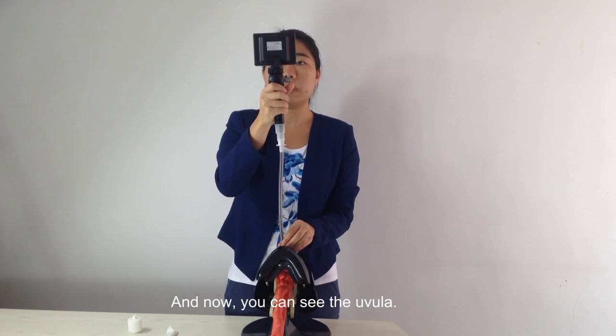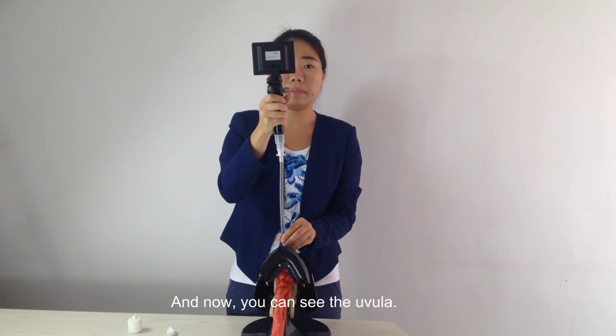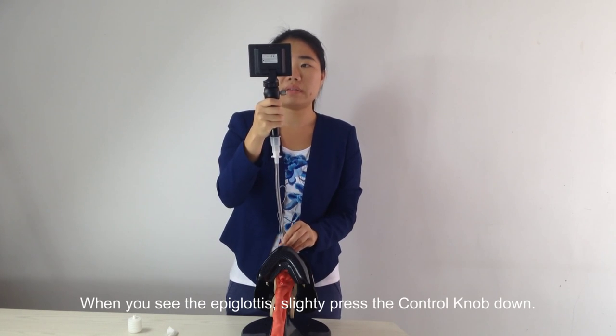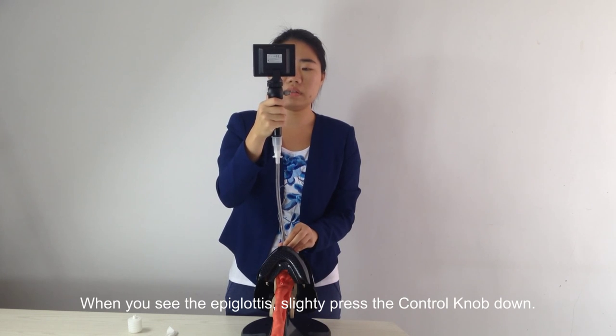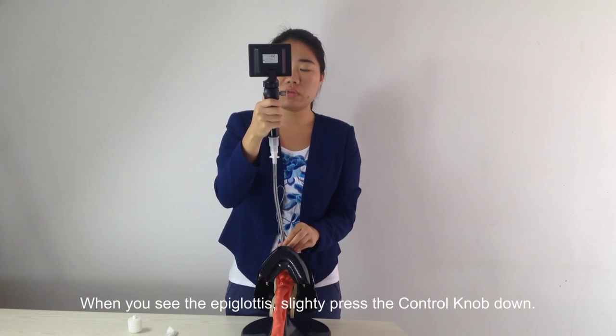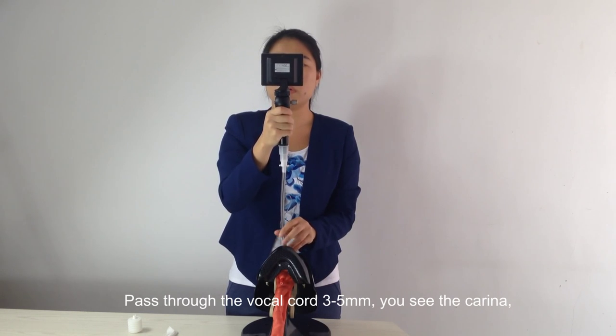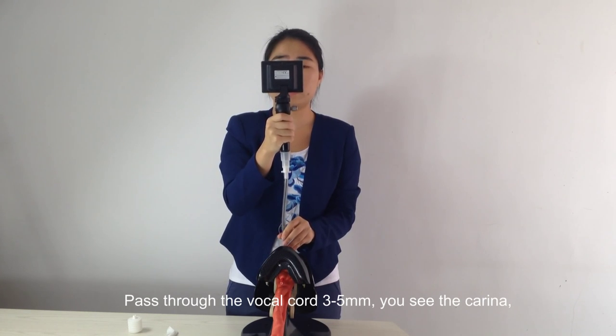Now you can see the epiglottis. When you see the epiglottis, slightly turn and press the control downward to pass through the vocal cords. You can see the tracheal rings.